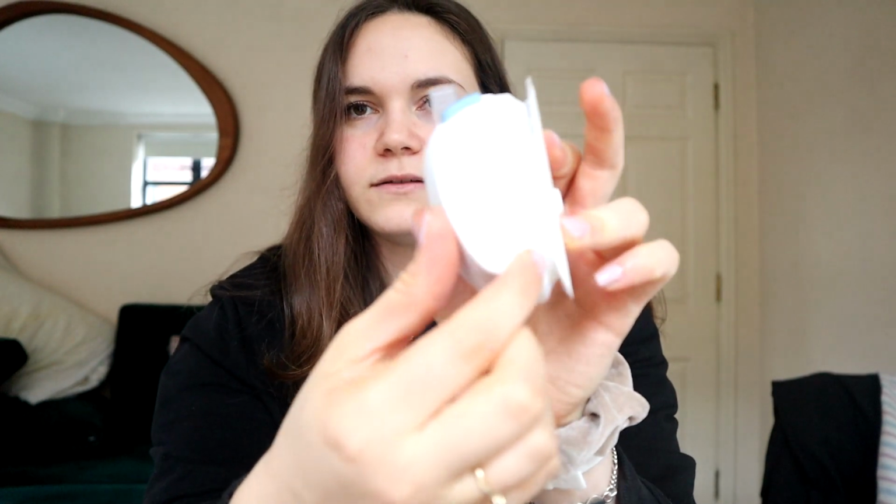To prime it, there's a little lever here, you just pull the lever all the way around and then let go, and now that is ready to inject. Obviously there's paper covering the sticky bit, but what I like to do is line it up on my leg with the covers still on to see where I want to put it. Then I take the covers off and put it on, and to put it in you just press the blue button. It can take me a little while to do. I stand there for ages, really bigging it up, even though it doesn't really hurt. Sometimes it does, but it doesn't really hurt. I just get nervous.